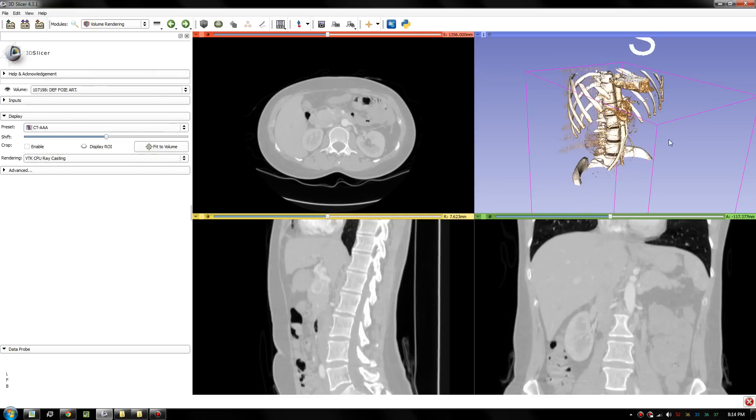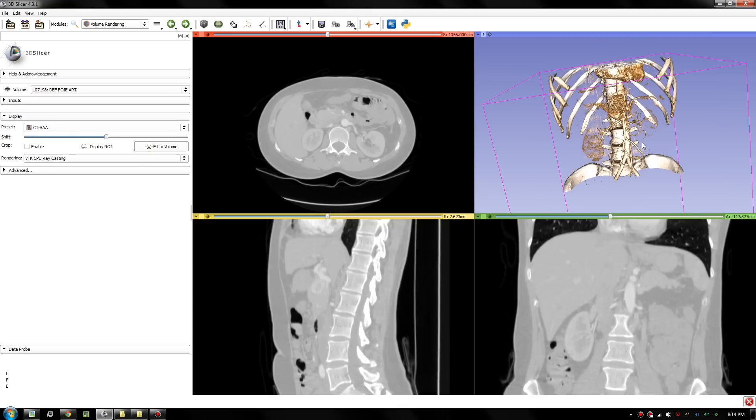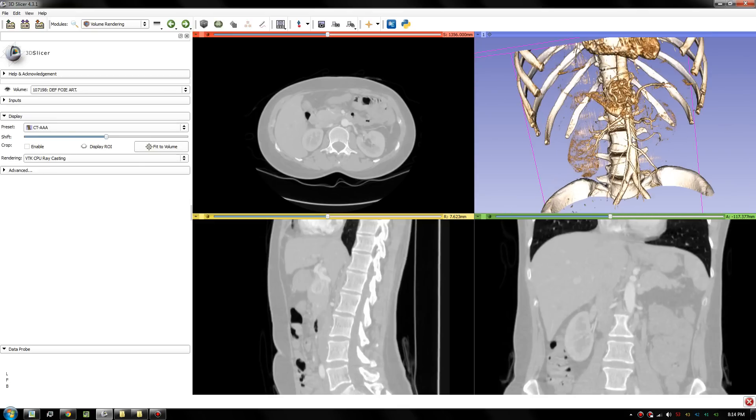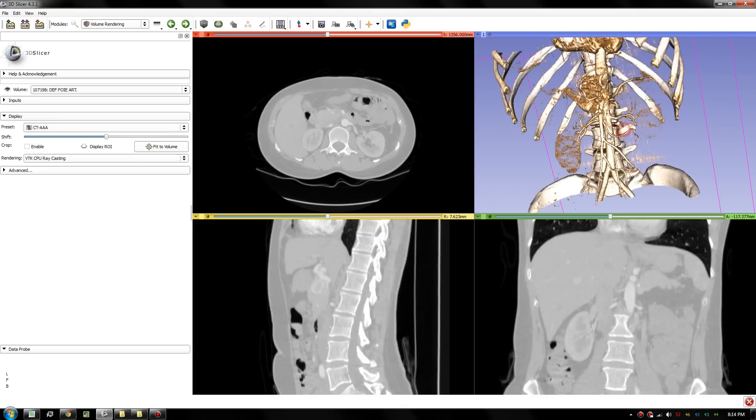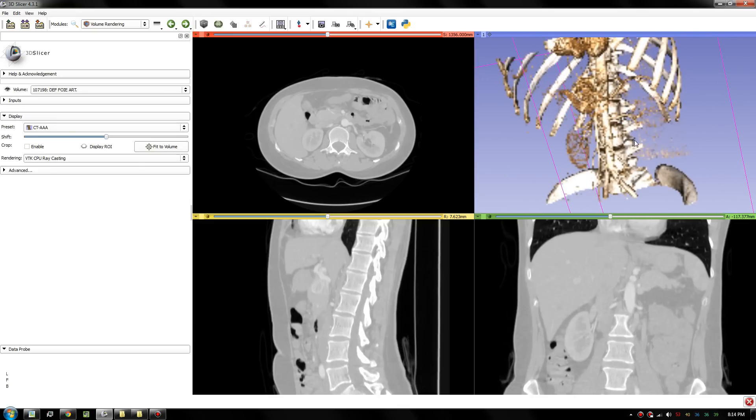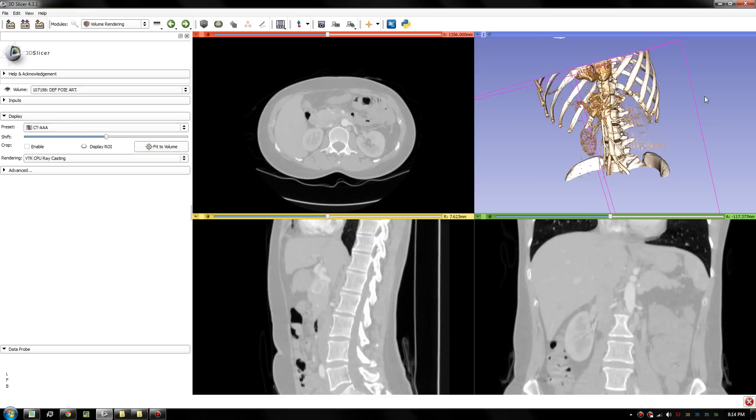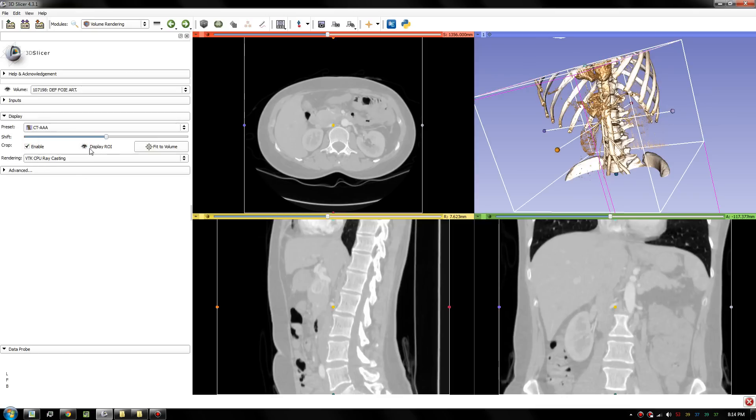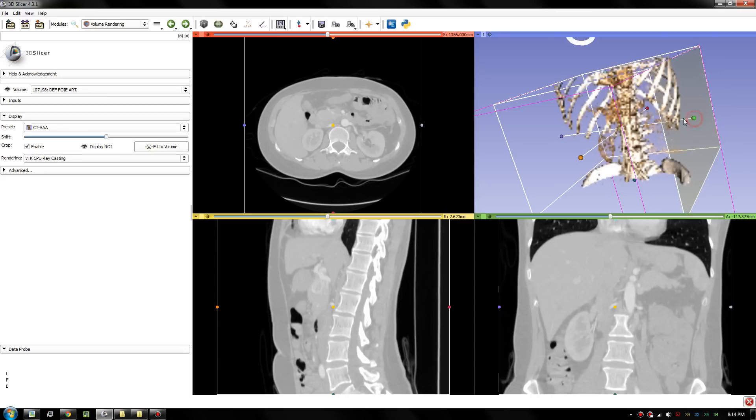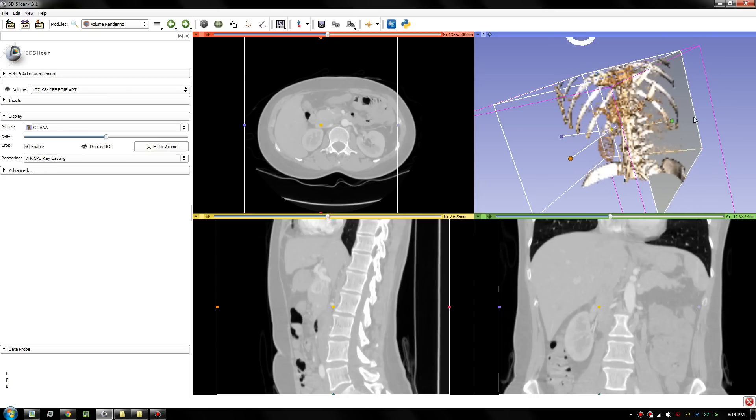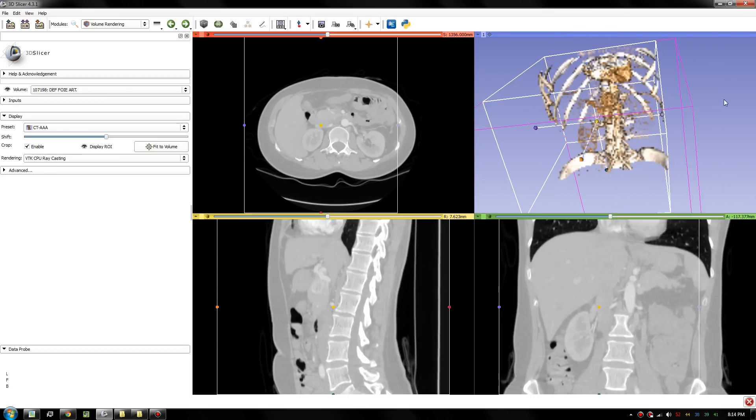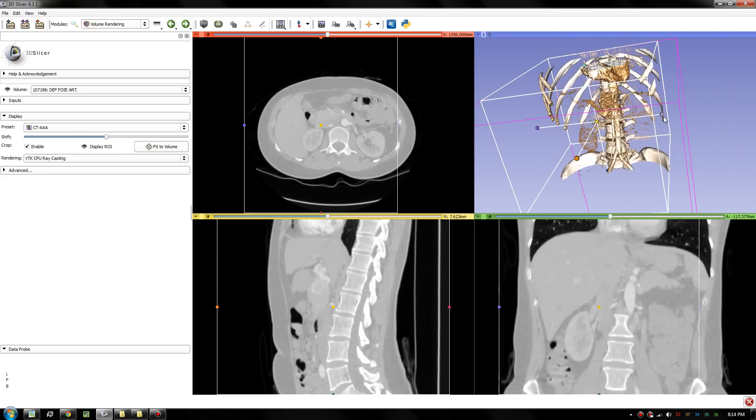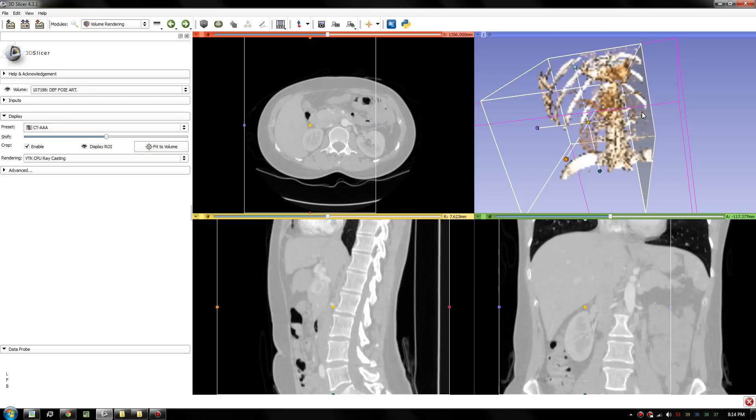Today we're just going to retrieve the spine model. Instead of loading the whole thing, we can crop that out. We have an option here to enable cropping. Display the region. So these balls here, we can drag them and redefine the region.